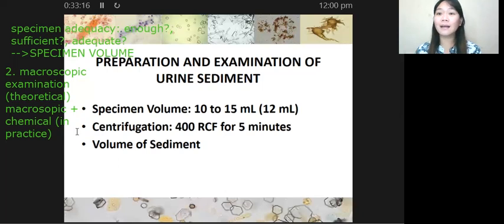Tama? Okay. Another, positive siya sa nitrite. Okay, turbid yung sample natin, homogeneous turbidity yung nakikita natin sa sample and then positive siya sa nitrite. Tama, bacteria. Nakuha? Ayan, red yung sample mo. Nag-positive siya doon sa blood parameter ng ating reagent strip. Ano ang ine-expect mo? RBCs. Okay, so yan. So it helps po na i-perform natin yung macroscopic examination at saka yung chemical examination because it will give us clues, okay, as to the different sediments which may be present in our urine sample.